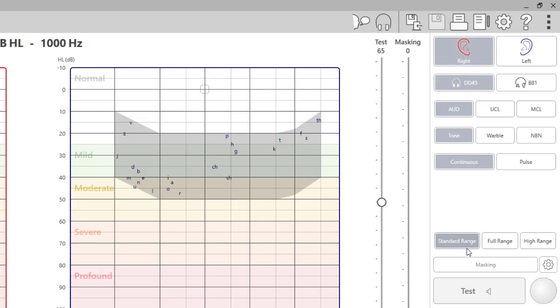If you have the stealth audiometer and have the high frequency option, the high frequency option may be displayed in three ranges. Standard range from 125 to 8K. Full range 125 to 16K. 20K can be turned on in the advanced options if needed. And then high range from 8 to 20K.